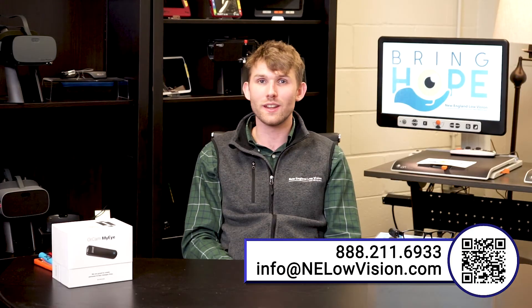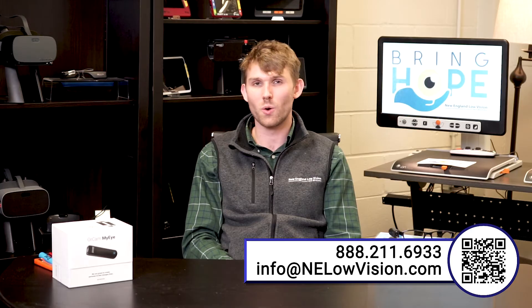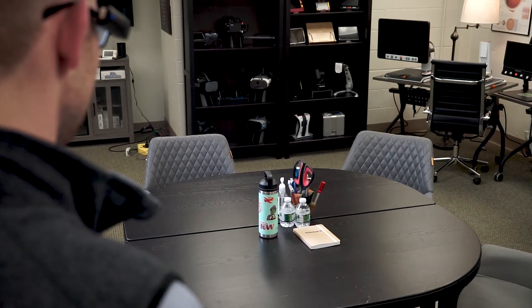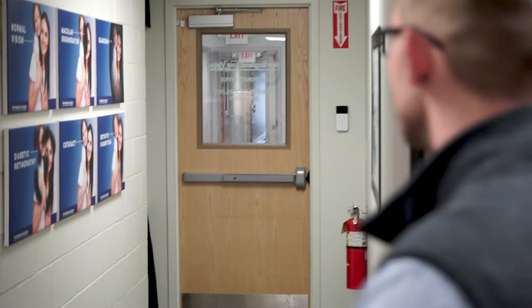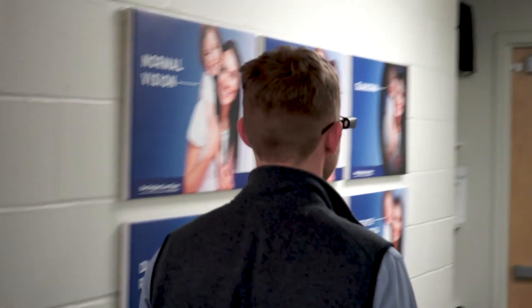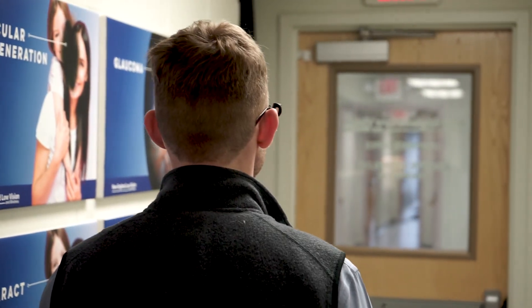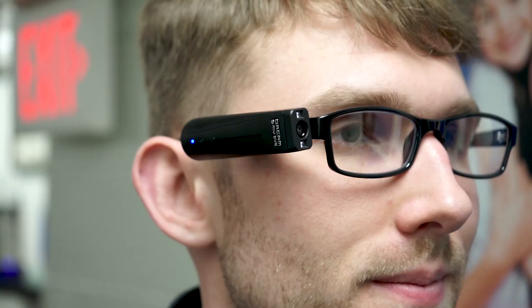If orientation and finding things is a pain point, OrCam has an answer with its orientation function. I ask "What's in front of me?" and it responds: "Two chairs. One to the left and one in the center. And a table to the right." Asking again from a different position, it says "A door. In the center." This is really good for exploring new places or re-familiarizing yourself with a place you frequent often.